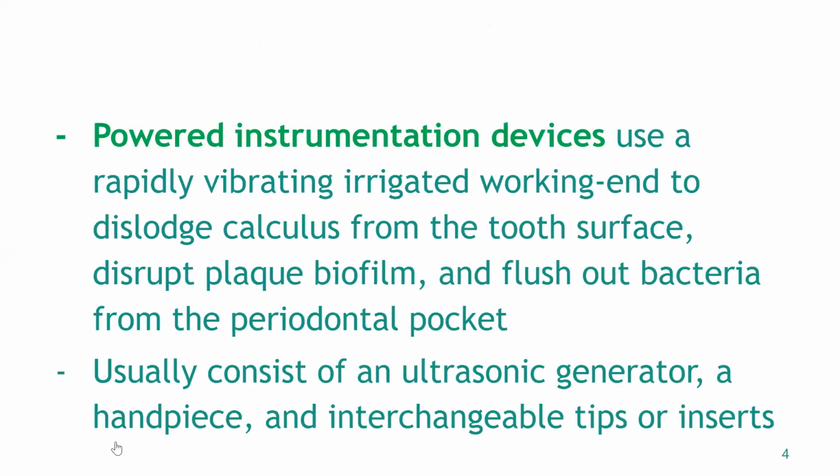Powered instrumentation devices use rapidly vibrating irrigated working ends to dislodge calculus from the tooth surface, disrupt plaque biofilm, and flush out bacteria from the periodontal pocket. They usually consist of an ultrasonic generator, a handpiece, and interchangeable tips or inserts.